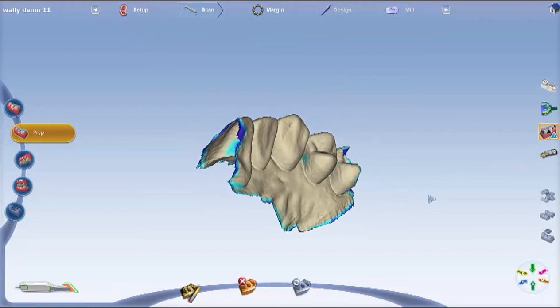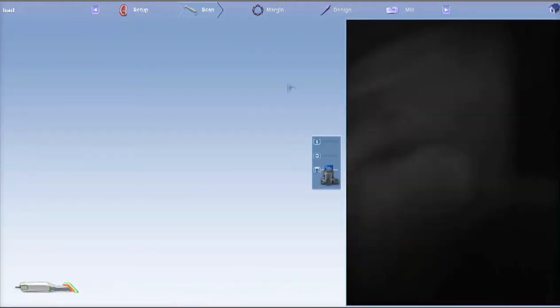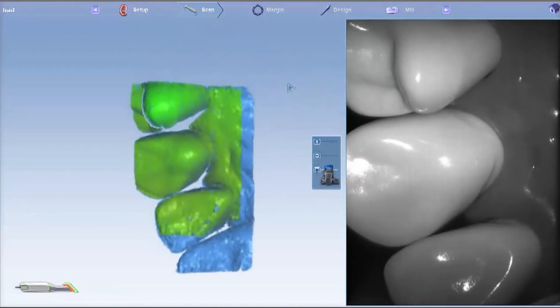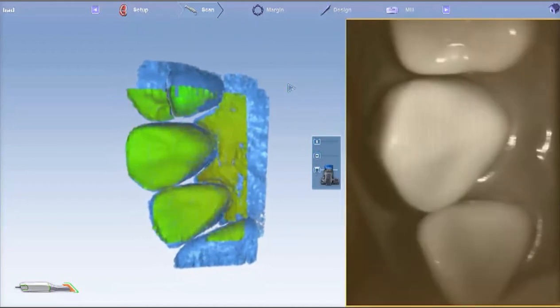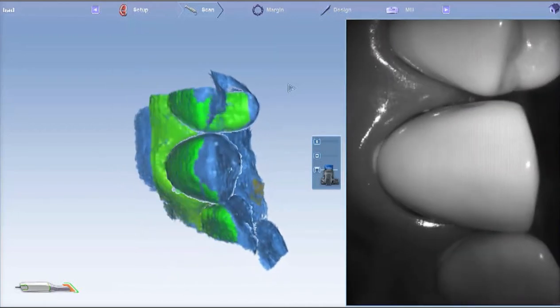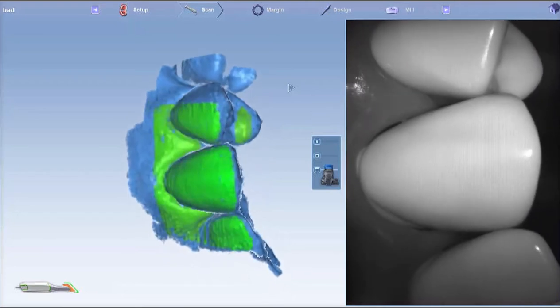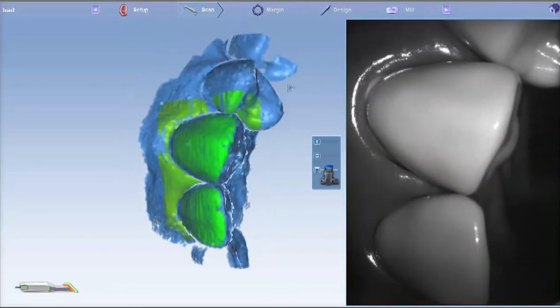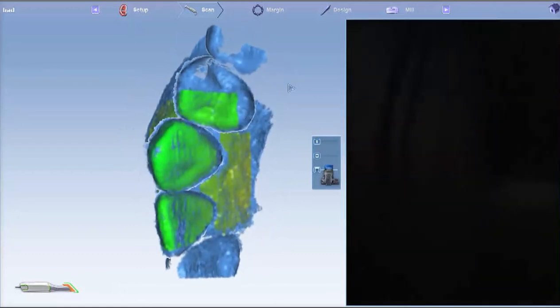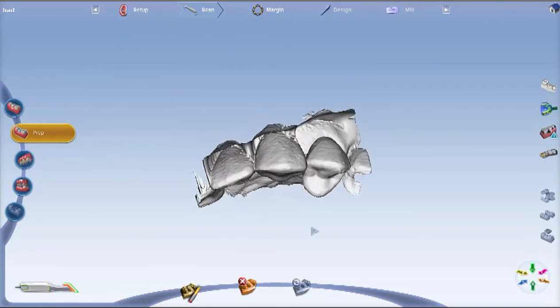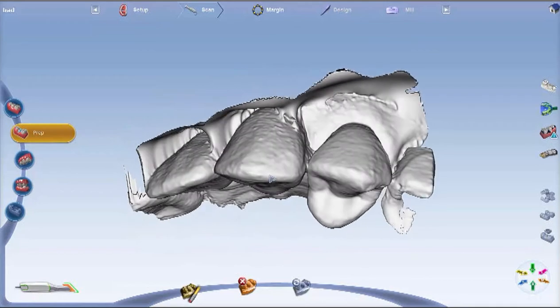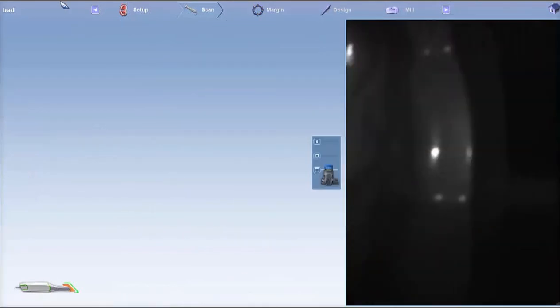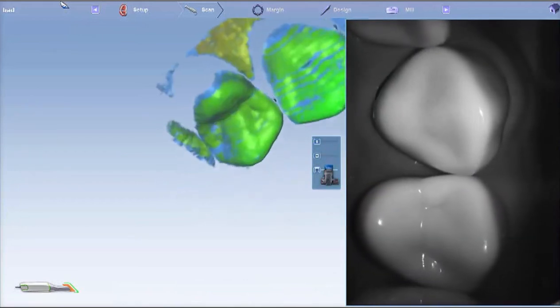There, we've gotten that area better. One thing you don't want to do is start scanning from a lingual view like shown here, or a straight facial view. This is what goes wrong when you don't scan from a straight-down incisal view. Here we're generating our model just like before, except we accidentally started from more of a lingual tilt. You can see it looks good on the lingual, but when you rotate that model around you have all this weird stuff on the buccal. The same thing happens if you start from a buccal tilt.